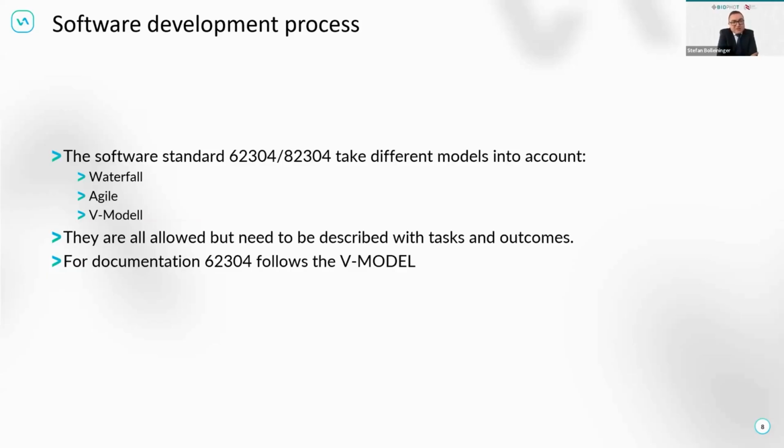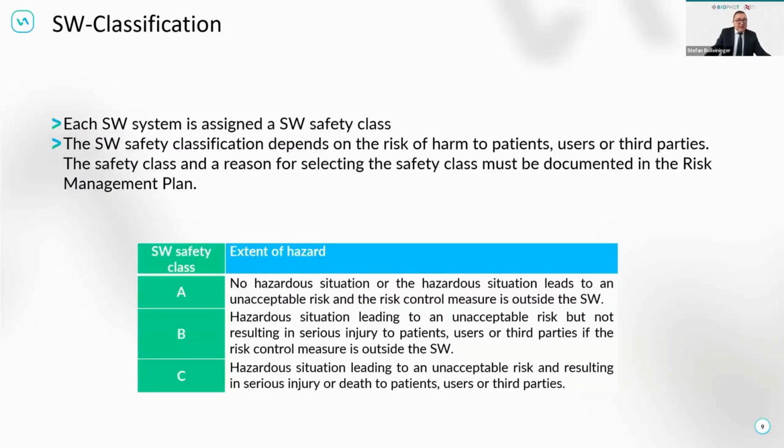However, then you need to watch out how to document the product, and that's two different things sometimes. So when we speak about the standards, they tell you a life cycle model, how to document a product, not how to develop the product. And that's a discretion you need to do on your own. And looking into how you want to do that, you can see that it is all possible. So, the first thing is the software development process gives you no limitations. You can do it in the way you want. However, and that is one of the points when we spoke first about the medical device classification, there's a risk-based classification. There is now another classification within the software, within the software development.